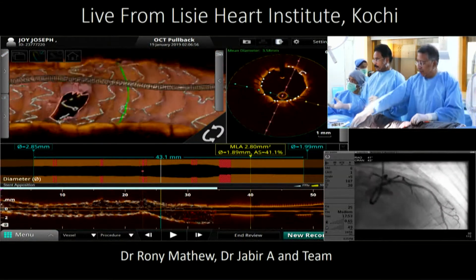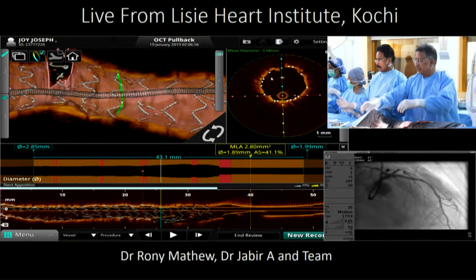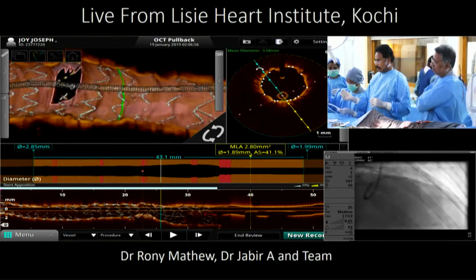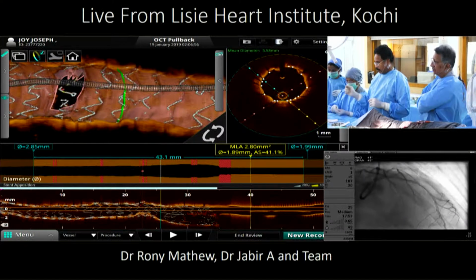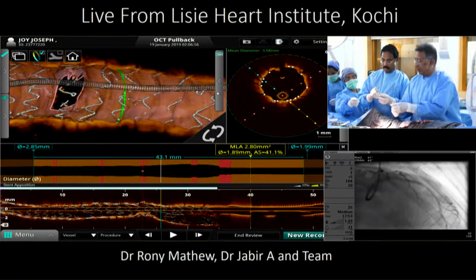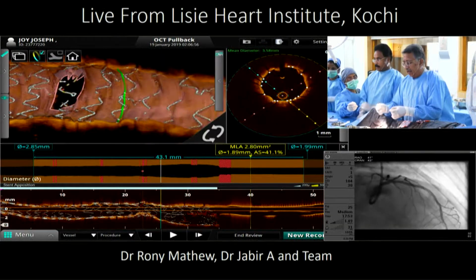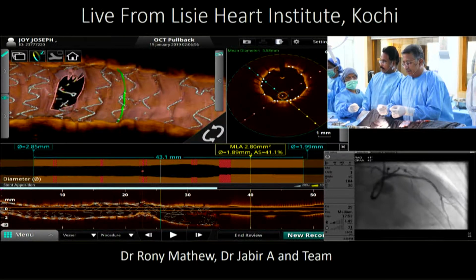Okay. Let me just focus. So we have two potential cells that could be crossed, because in order to get a good result, we need to cross a cell that connects to the carina. So it might be this one or this one. Keep discussing. Okay. This one or this one, and yeah, I think that this one is maybe easier to cross. What do you think?